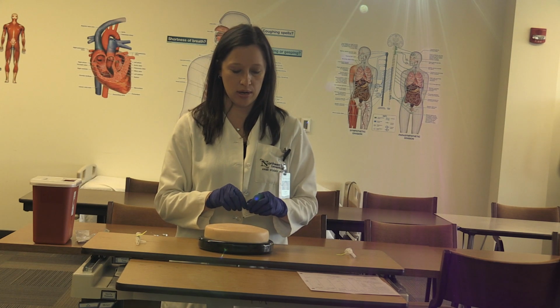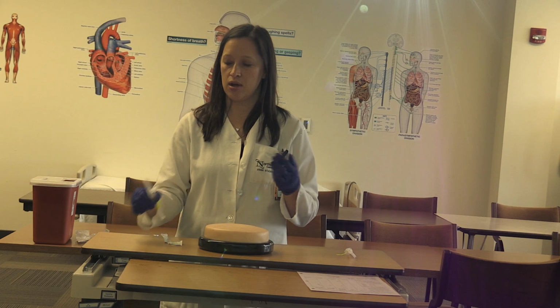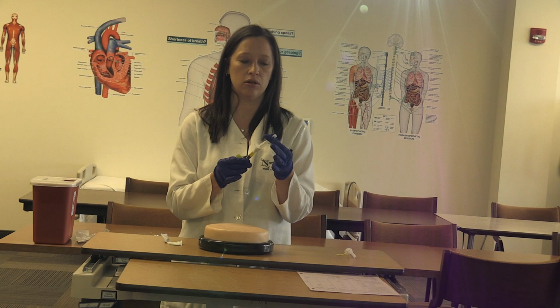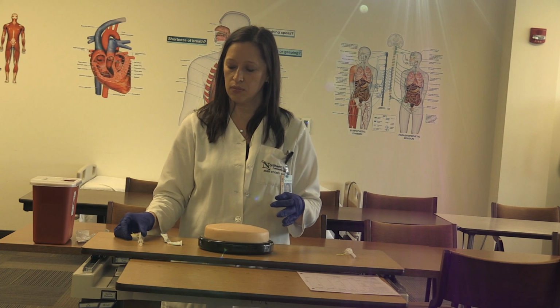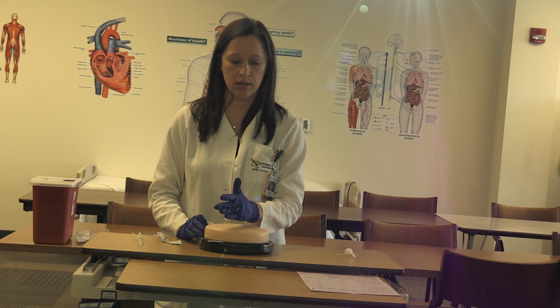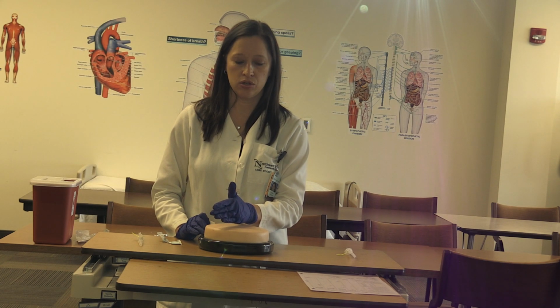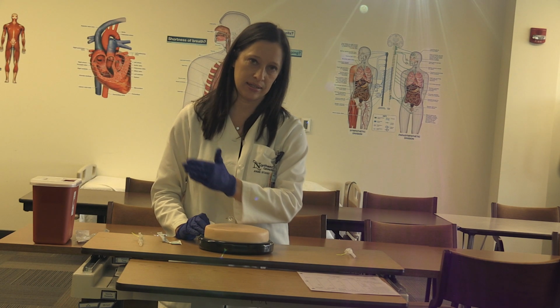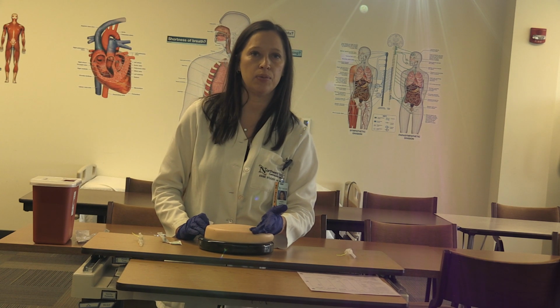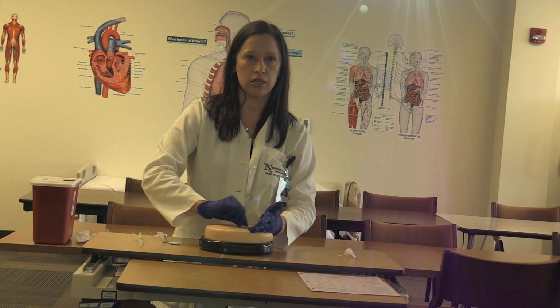So when you are getting ready to do a Z-Track method, you're going to need to cleanse your site with alcohol, and then I would recommend loosening your needle cap. So the point of a Z-Track injection is to keep the fluid from draining back out. So we're going to pull the skin to the side. You're going to just take your patient's skin and pull it to the side, keeping it kind of taut. And then you want to cleanse the site vigorously, 15 to 30 seconds.